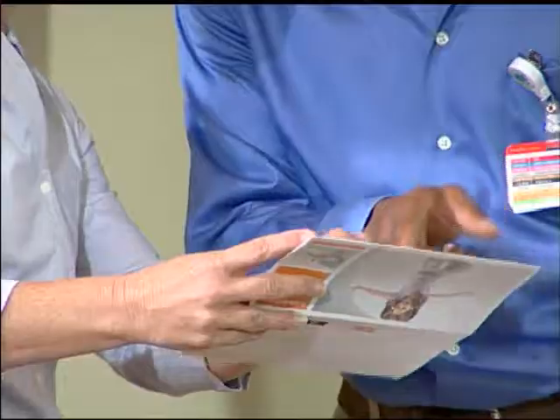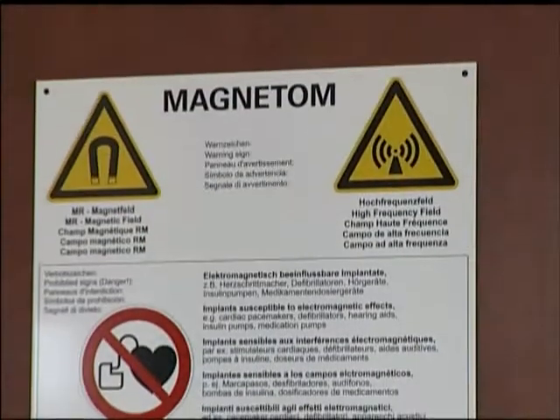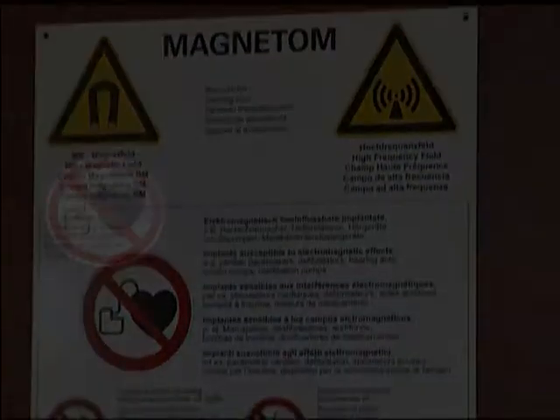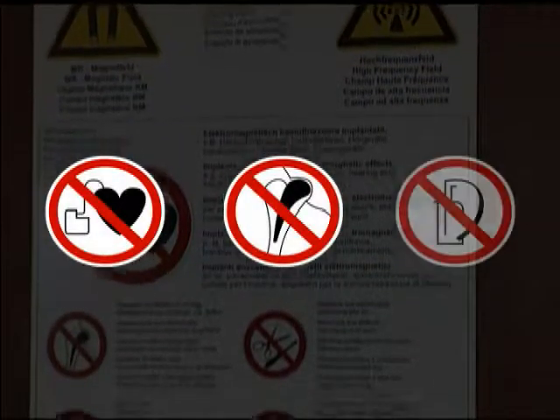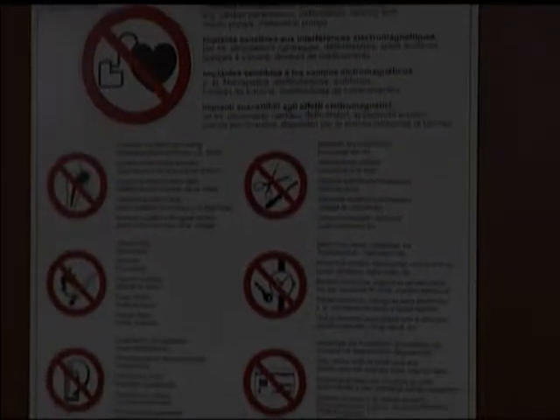On the day of your examination, it's a good idea to arrive a little early in order to complete your patient information records and to allow for a pre-examination screening. At this time, you may be asked some questions to make sure that you are eligible to undergo the MRI examination. For instance, patients with metallic foreign bodies or surgically implanted devices, like cardiac pacemakers and aneurysm clips, are not eligible, as these devices may be adversely affected by the magnetic field.